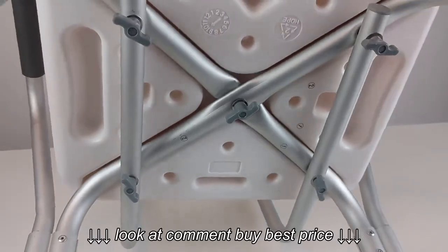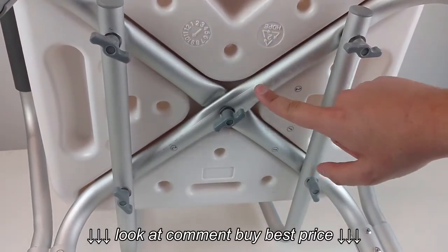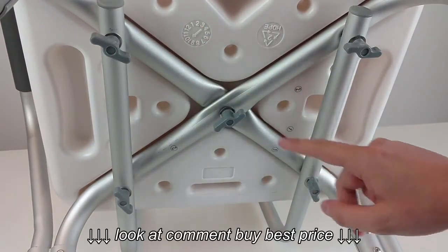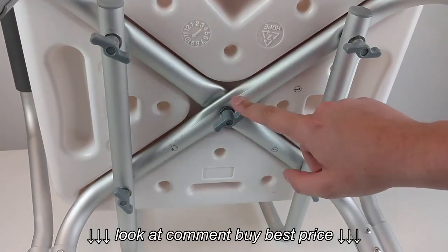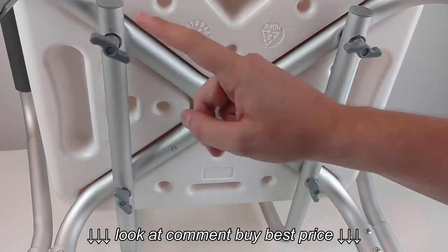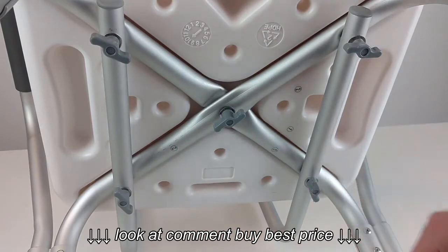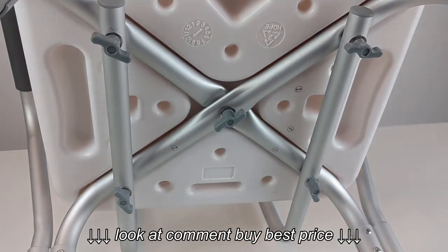Just remember: section one attaches first, then section two. You'll fit the back rest on. You can tighten down the two leg pieces with the short screws, but wait until you get the back rest attached before you use those long screws, and you'll be all set.